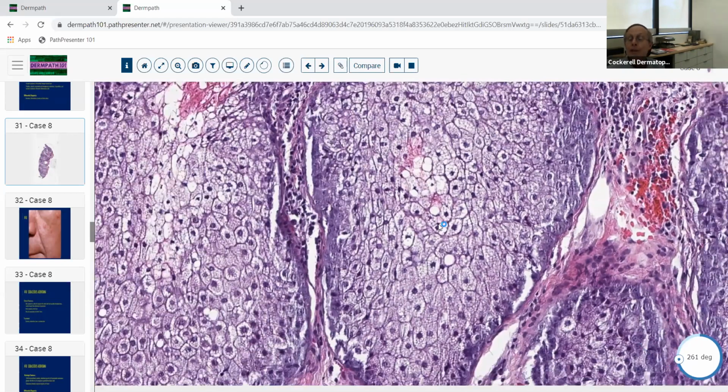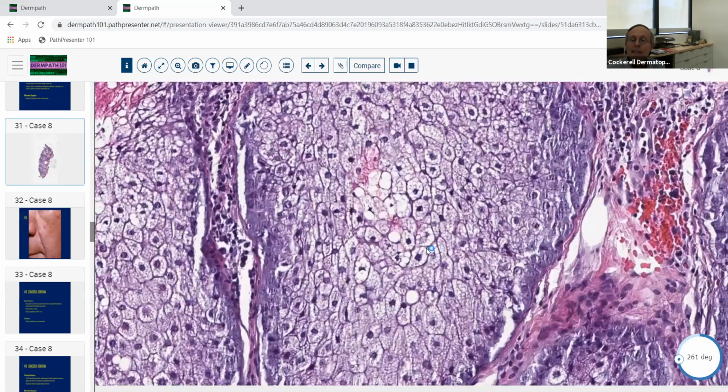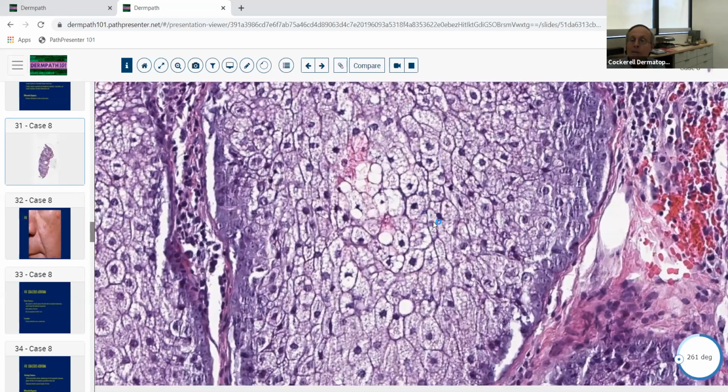It's glandular epithelium, and we have really just three major glands in our skin. We have eccrine glands, apocrine glands, and then we have sebaceous glands. There are some other glands elsewhere, but those are the three main ones that we have in our skin. So of those three, which one is this? Well, it's obviously got the bubbly cytoplasm. It's got the little stellate nuclei here with these small gossamer strands of, I guess, cytoplasm probably, or nucleoplasm. They're in there. So this is sebaceous, classic.